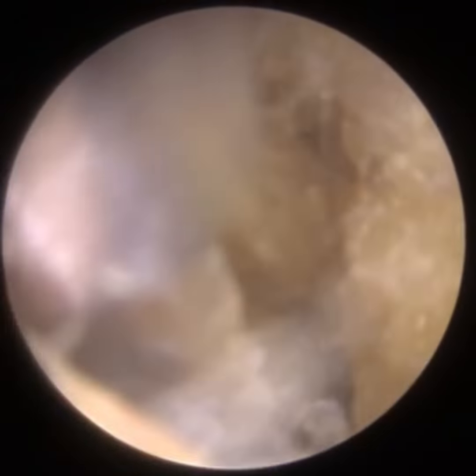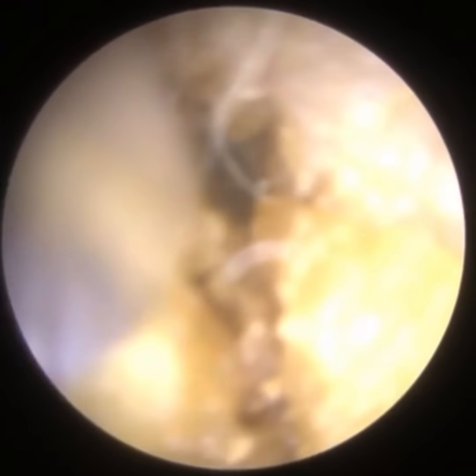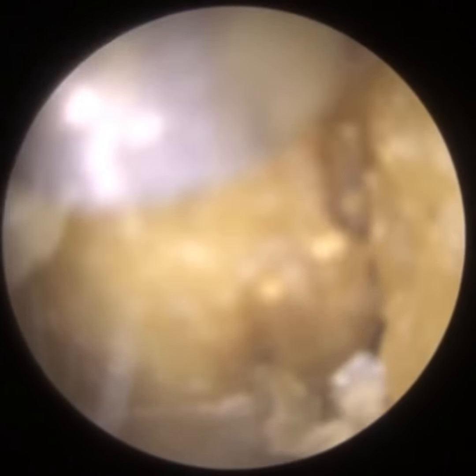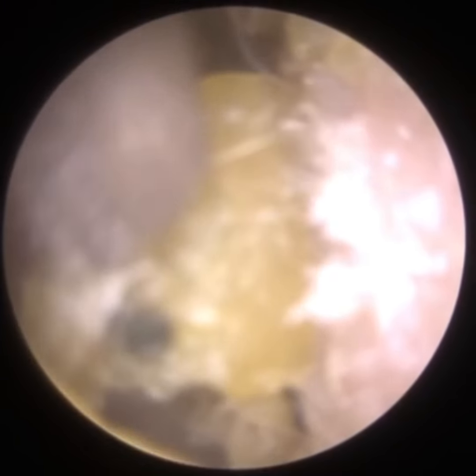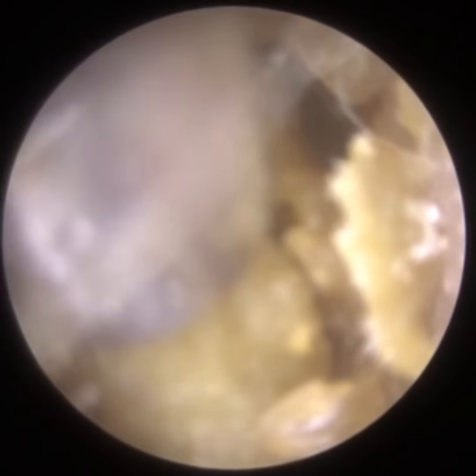And with this dead skin, so with this otitis externa, this skin, as it dies and sheds, it's just like psoriasis. The skin just builds up inside the ear, and the skin also gets infected. They generally get loads of fungal spores. As you watch this right ear procedure unfold, there is some residual dead skin keratin that's embedded onto the eardrum, and you'll see a few fungal spores there. So the patient is prescribed some earwax drops and also some cream to apply as well. Cream can always be a bit difficult to apply inside the ear, but the patient's been doing it for a while now, so they've become accustomed to do this safely.